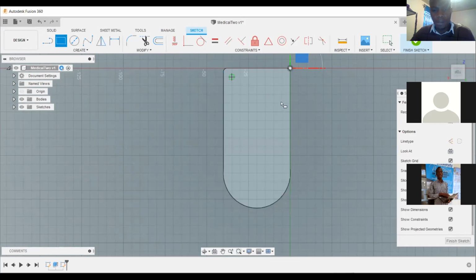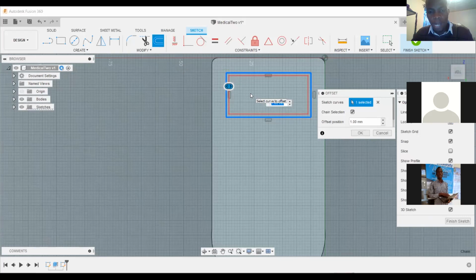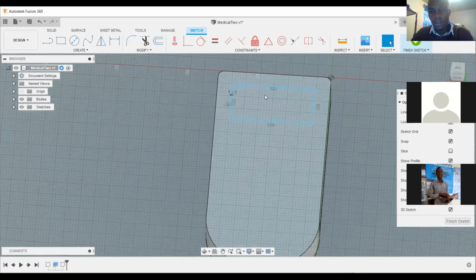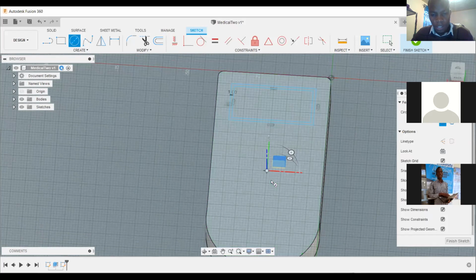Then drawing a screen is very simple. You just draw a rectangle like that. Since you have that, you can decide to use offset. So click offset, then you click this, and it's doing it for 1 millimeter. Yeah, sure. So it's very simple like that. Then you can decide to put other things here, like a button.